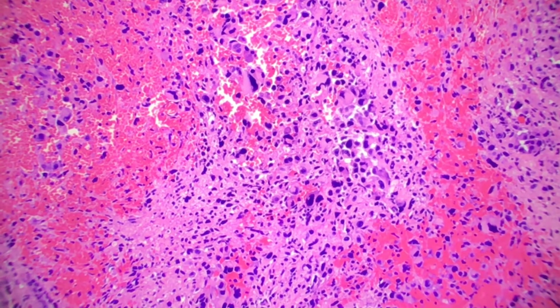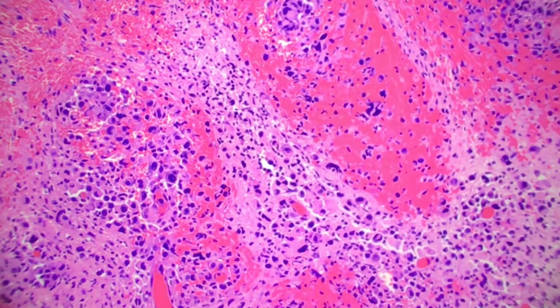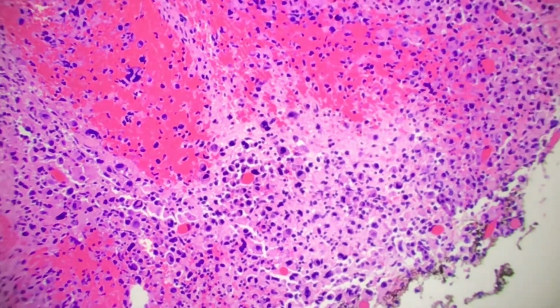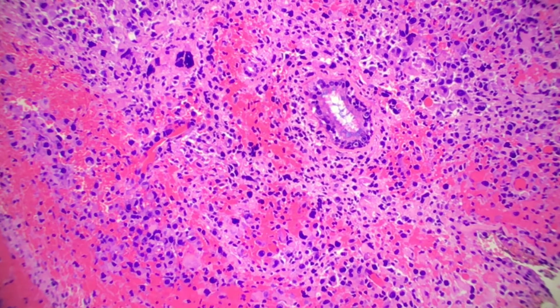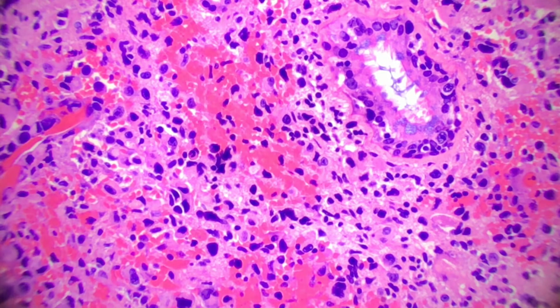So this lesion has a lot of one feature, which as I drive around, you're going to see a lot of it. There's a lot of tumor giant cells, okay? The cells themselves in this lesion are a mix of features. So mucosal melanomas can be like other melanomas, right? They're mimickers, so they like to take on various shapes, forms, you name it. So we have some really nice sinonasal epithelium with gland formation up in our top right corner, and it's surrounded by this lesion.